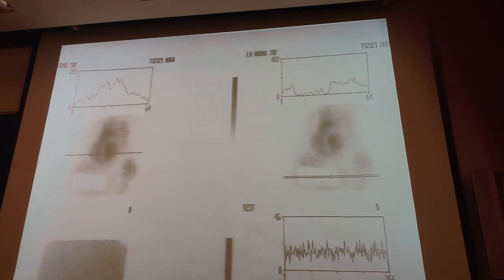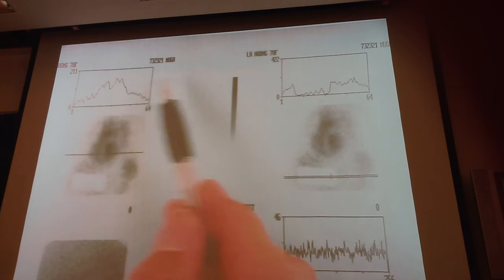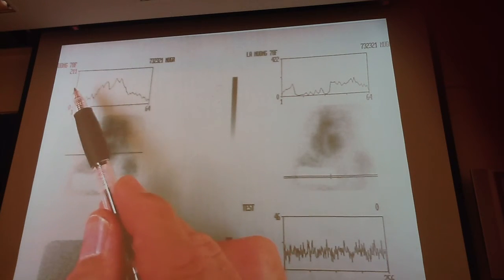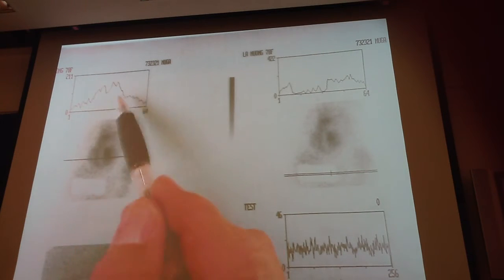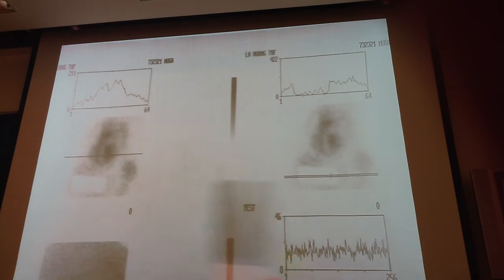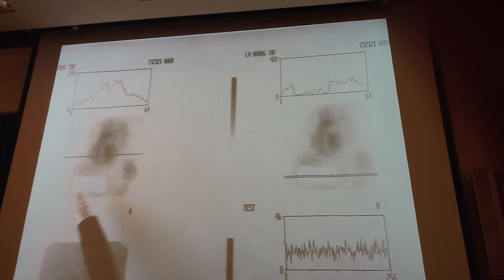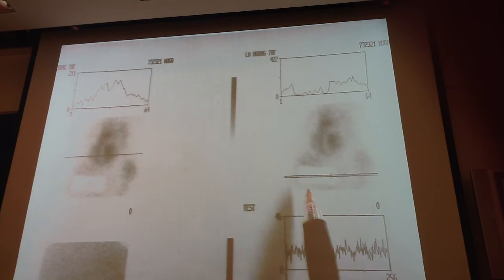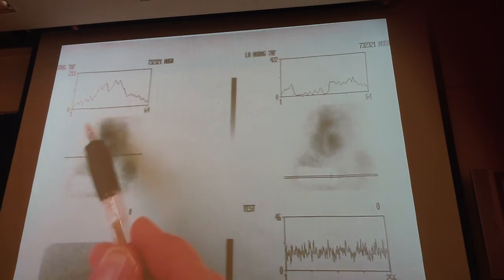As the image is coming into your computer, it goes in one line at a time, or if we use an array processor, then all 64 lines are converted at the same time. But basically, if you drew this anywhere on your image, this is what that three-dimensional information looks like to your computer. This is one line of information down here. This is the one line of information going through the heart.